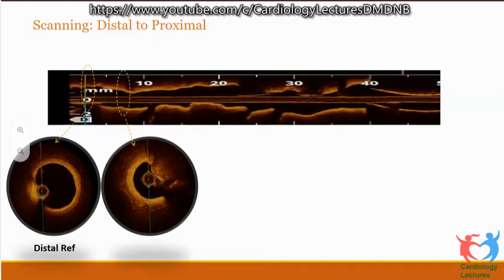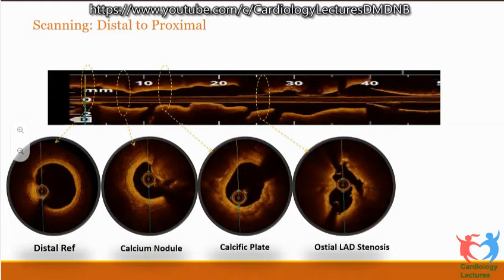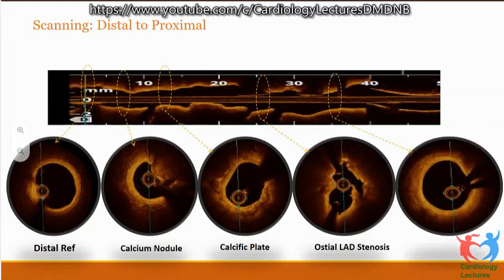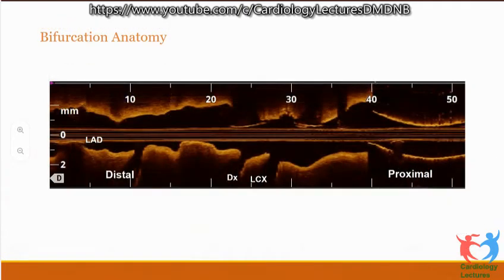So what you see is the reference which we got. We see a calcium nodule segment. We also see some calcific plaque. This was ostial LAD with dissections. This was a balloon-induced dissection because it was a very tight lesion here, and the proximal left main segment also has some amount of plaque burden. So this is how you assess the bifurcation anatomy on a longitudinal view.